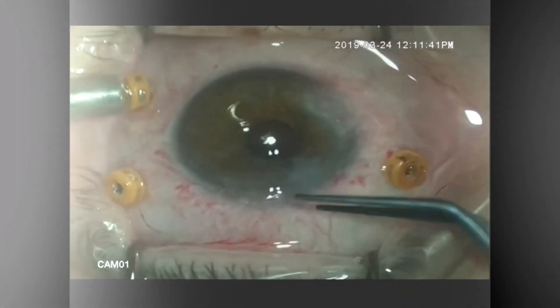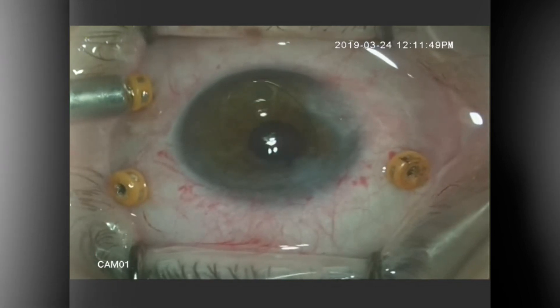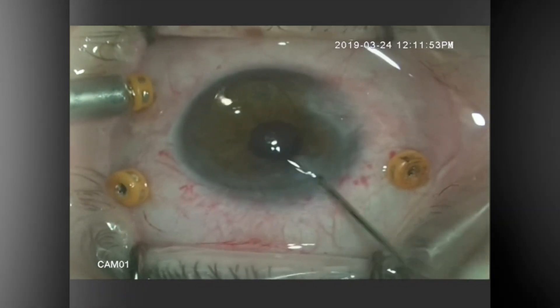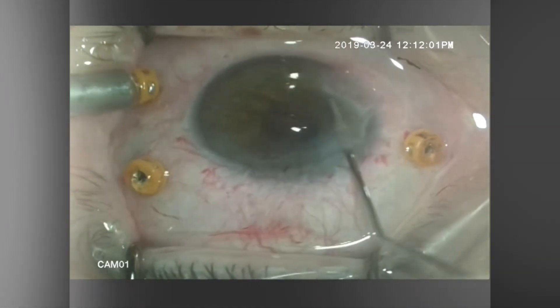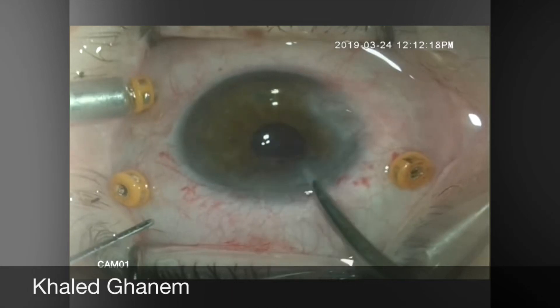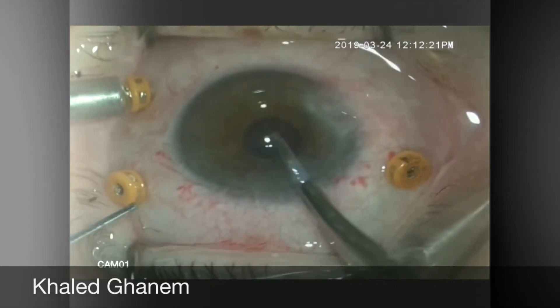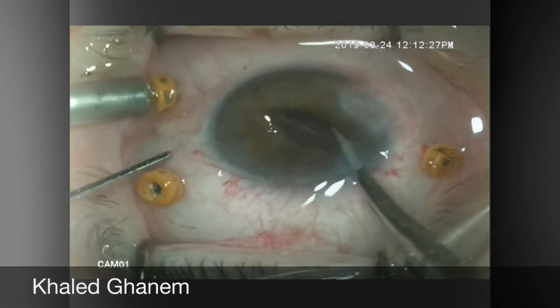After the IOL is explanted, another iris-claw lens will be introduced inside the eye, which will be rotated in order to be grasped by the forceps, and then it will be pushed under the iris.